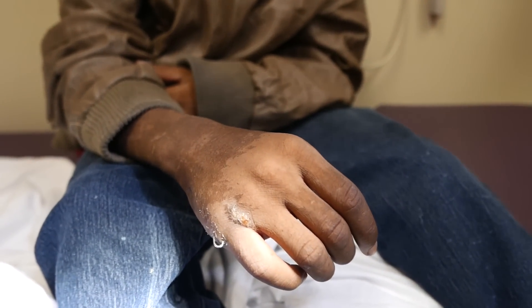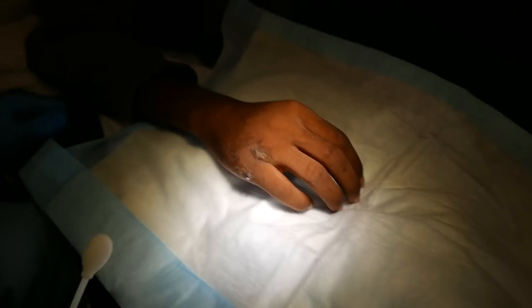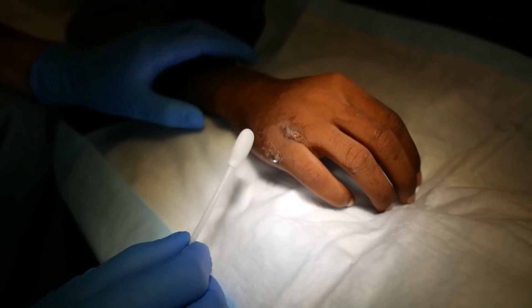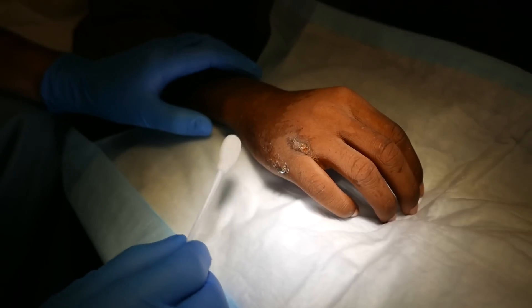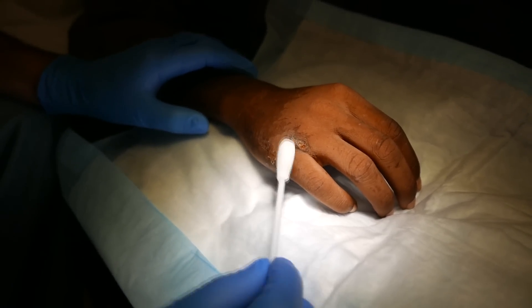We've talked to plastic surgery and the hand specialist, and we're going to go ahead and pull out this other pin. I have a student working with me here, and he's going to talk about K-wires or Kirchner wires while he's cleaning, and then we're going to pull this out.